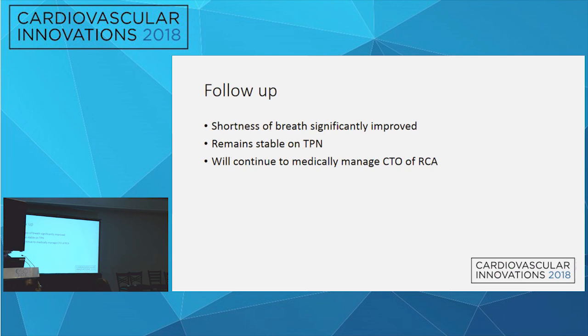I think that's a great case showing how planning actually is helpful. You do the CTA, see the size of the vessel. I mean, during that episode of no reflow, if you didn't have your Impella, this could be a disaster. It would have been, yes. Yes, exactly.